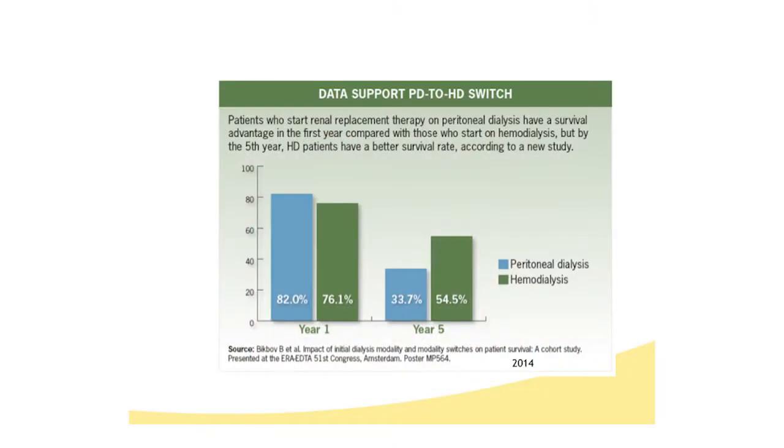Peritoneal dialysis is best for patients who still have some degree of kidney function. And that's what all the studies show. This shows the survival, compared to normal, of dialysis patients on PD in the blue. And then at year 1, it's better than hemodialysis patients. But at year 5, it's worse, because they lose the filtering capacity of the membrane. So that's an incentive to maybe start on peritoneal dialysis, but later switch to hemo.